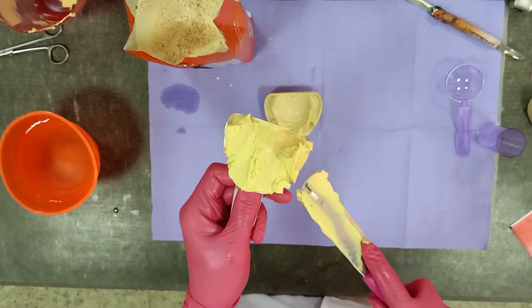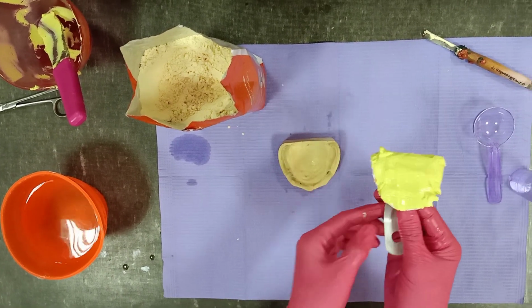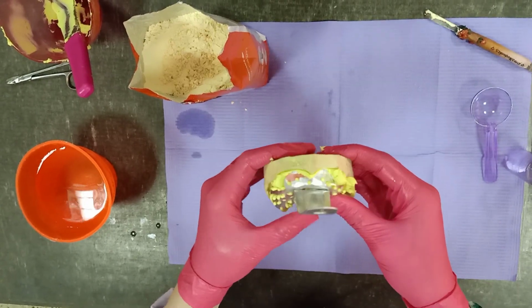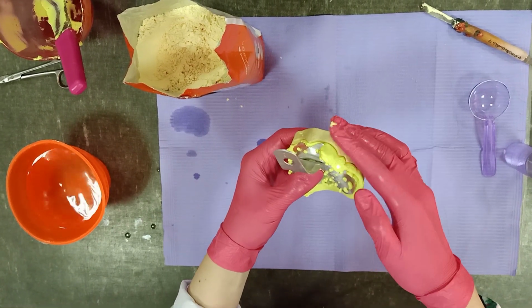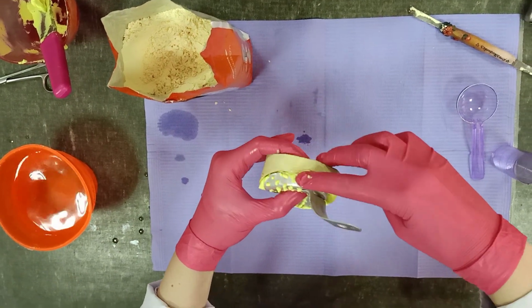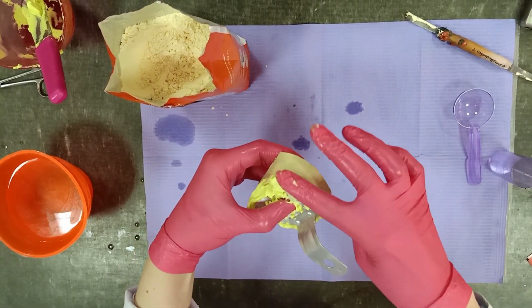Now it's ready to be inserted in the patient mouth, and here on the cast, use some water to make the surface smooth, inserting the tray posterior first, then anterior. Press till you are sure that all the borders are getting alginate in them. And now start doing trimming. Here we are using our fingers instead of the anatomical trimming by the lips and cheeks in the patient mouth.